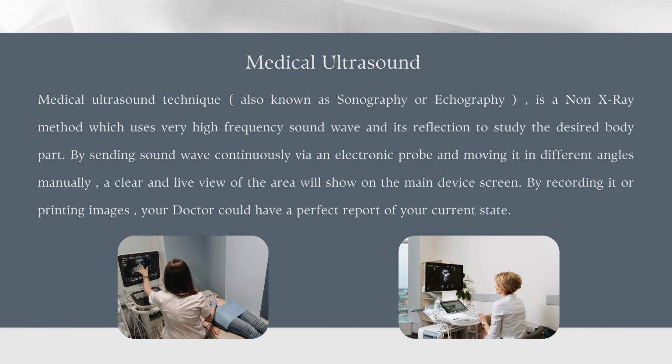And now let's check out medical ultrasound. The medical ultrasound technique, also known as sonography or echography, is a non-X-ray method which uses very high-frequency sound waves and their reflection to study the desired body part. By sending sound waves continuously via an electronic probe, and moving it in different angles manually, a clear and live view of the area will show on the main device screen. By recording it or printing images, your doctor could have a perfect report of your current state.